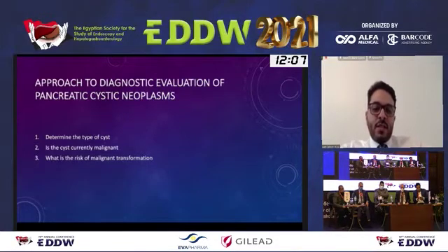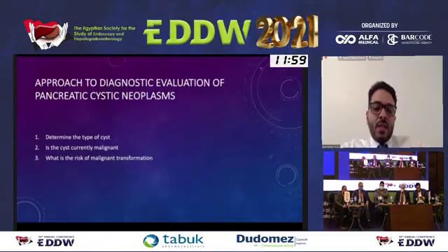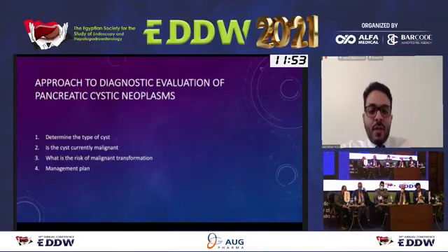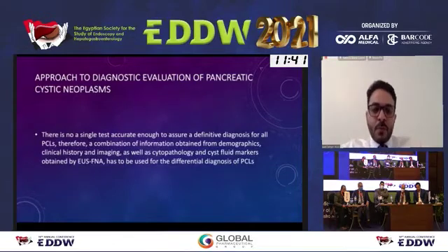If they are mucinous cysts, then the second step is to determine if they are malignant or not. And if not, then you're going to have to determine what is the risk of malignant transformation. After answering this question, you'll be able to decide about the management plan. Now, in order to answer all these 4 questions, you have to utilize every single piece of information you can from history, from images, from endoscopic ultrasound, and fluid analysis.